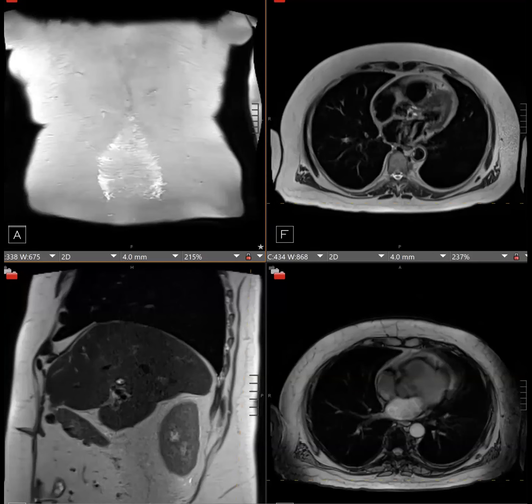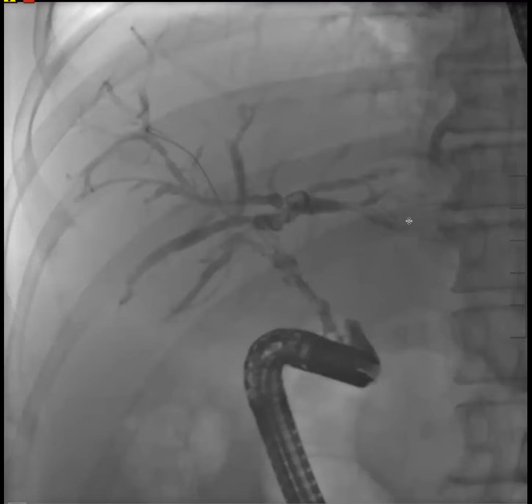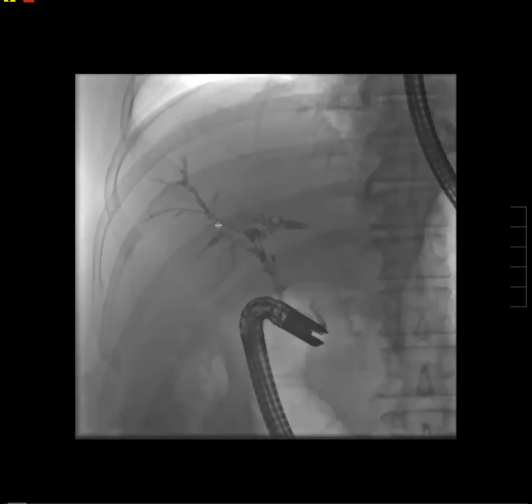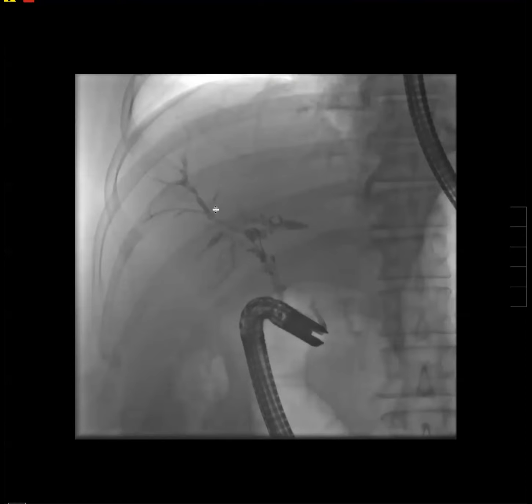Yes. This is a patient who is status post liver transplant, and after transplant, the patient developed abnormal LFTs and was found and had been managed for ischemic biliary ischemia, so ischemic cholangiopathy after liver transplant, and has been getting ERCP with dilatation.